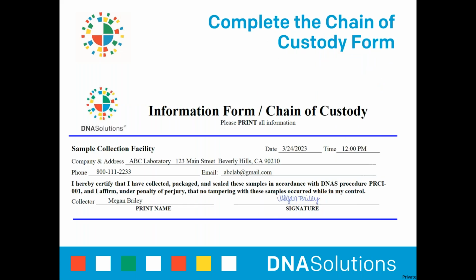The top portion of this form indicates the date, time, and location a collection takes place, as well as the individual who performed the collection. Please make sure the date and time of the collection is provided, as this is a requirement for our accreditation as well as many court systems. If you are collecting individuals on separate dates or the same day but different times, you want to be sure to have a form for each different collection you perform, regardless if they are for the same case.